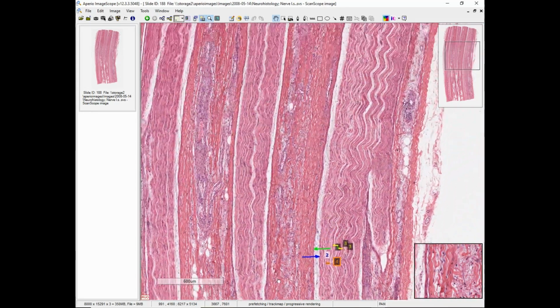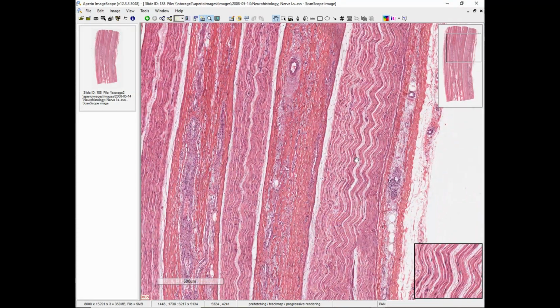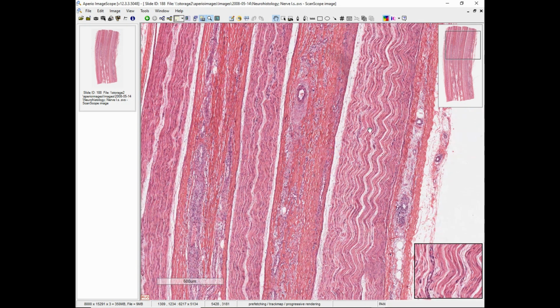Now just over from that, we come to nervous tissue. And I'm going to zoom out again, and we'll pick up right here, because this is a nice illustration that nervous tissue tends to have this undulating appearance in longitudinal section. Basically, it's got this wavy appearance. It's kind of smooth. So this is what a nerve fascicle looks like. So we've got the epineurium on the outside, but then we've got connective tissue here separating this fascicle from its neighbor. So this is going to be perineurium.